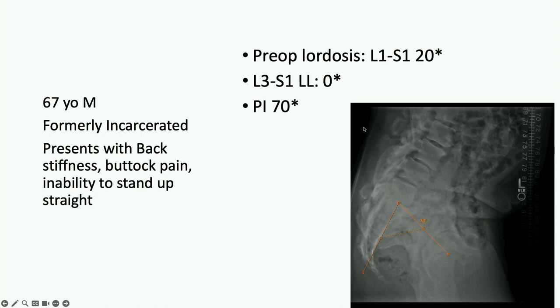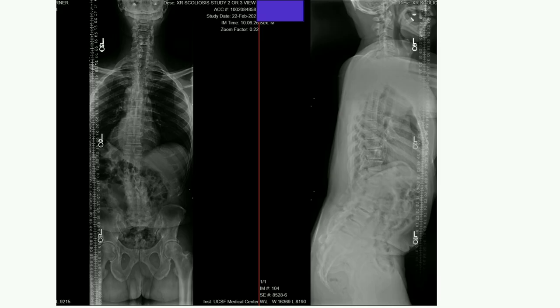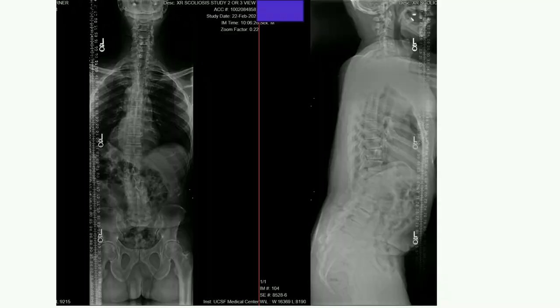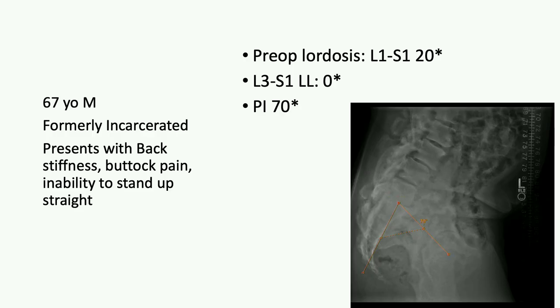Looking at his lower lumbar spine: lordosis of 20 degrees, but from L3 to S1 it's really completely flat, with a high pelvic incidence of 70 degrees. His standing scoliosis x-rays show he is auto-fused from L3 to L5 with very dense bridging posterior fusion. This space is open.